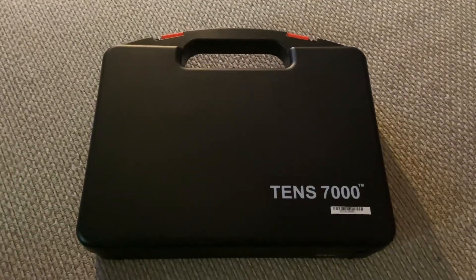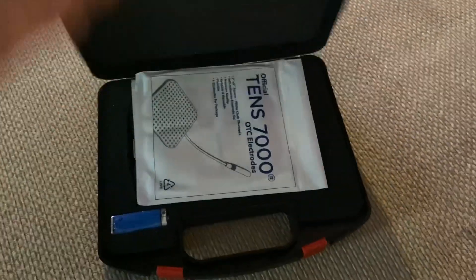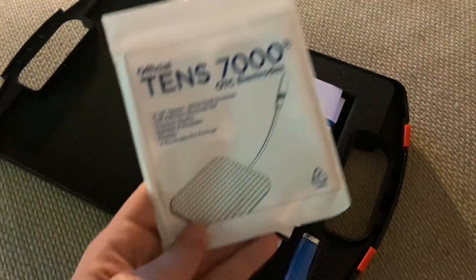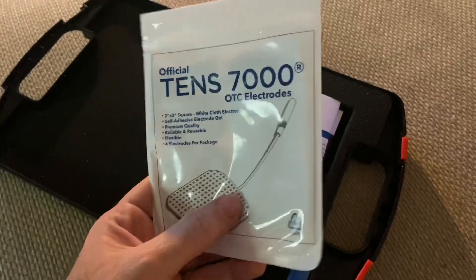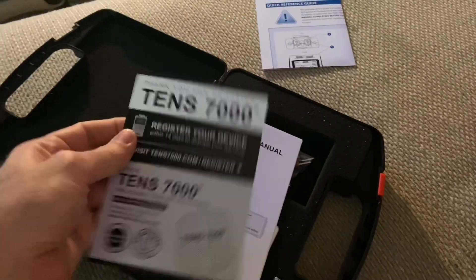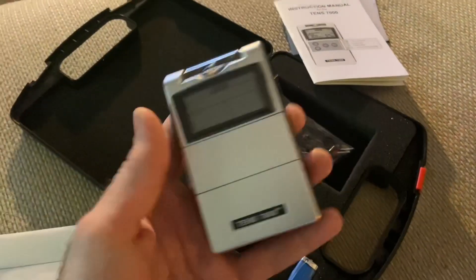Let's open it up and see what's inside. I like this carrying case. Here are the electrodes — just self-adhesive gel pads with an electrode that you place on your skin. There's also a reference guide, registration, and instruction manual, and then the device itself.